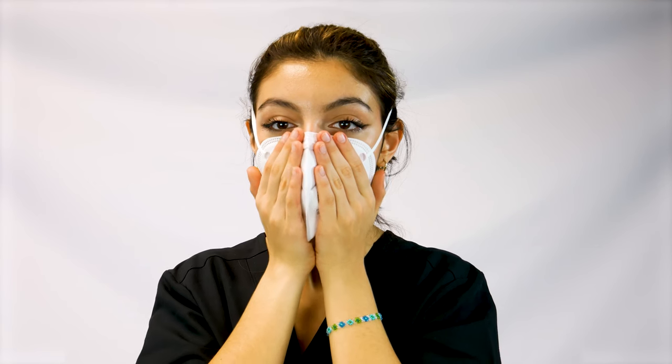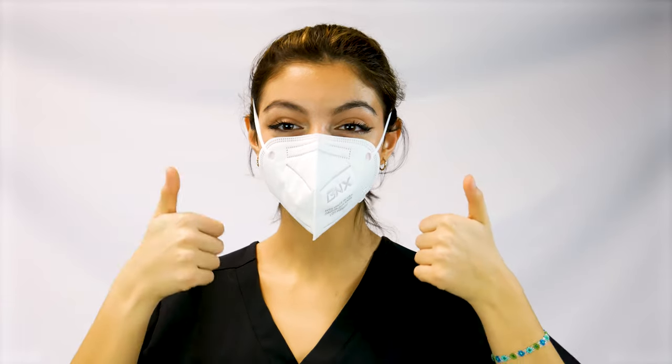Cup both hands over the mask and perform a seal check where you breathe in and out forcefully a few times. Ensure there is no leakage around the edge of your mask. And that's all there is to it!